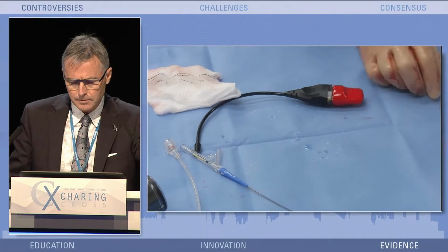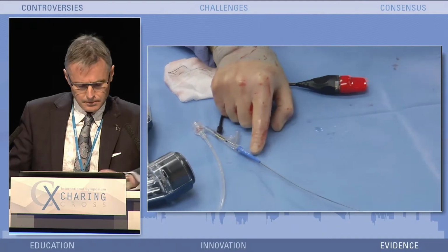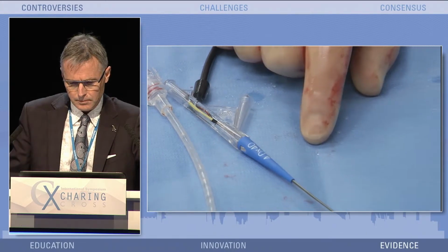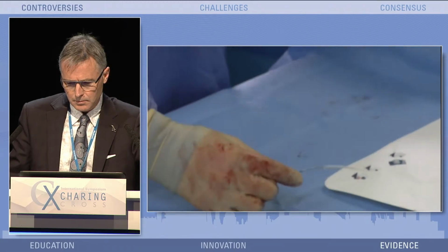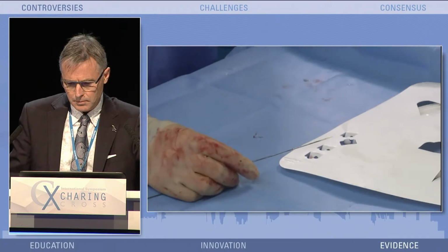So this is the Shockwave S4 catheter. This is a 4 millimeter diameter, 40 millimeter long balloon catheter. Once again, you can see it's got a wire in the central lumen, and it comes with also an outer cover which we'll take off here.